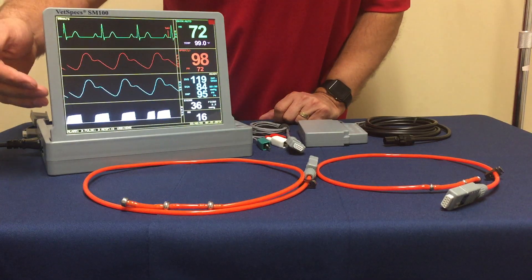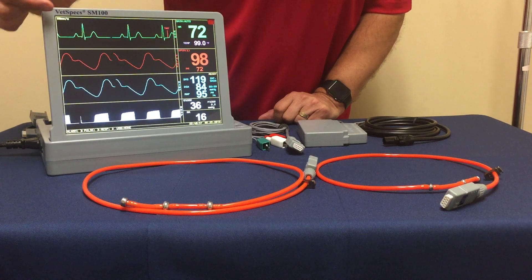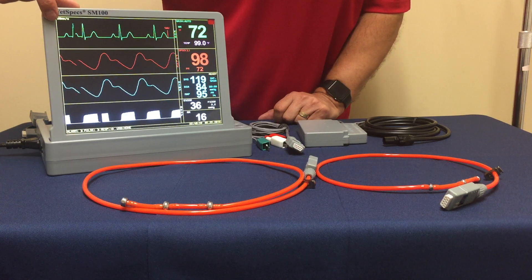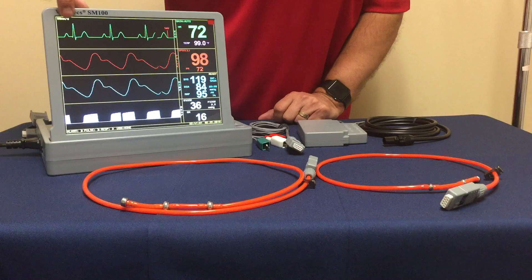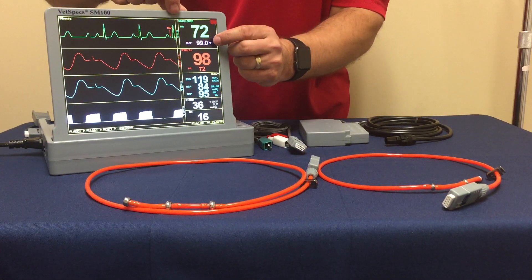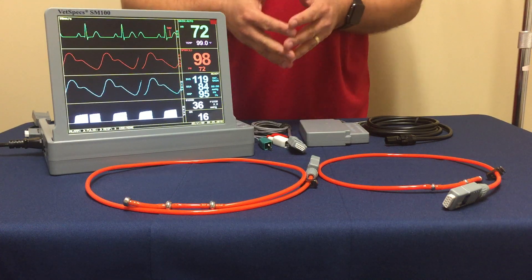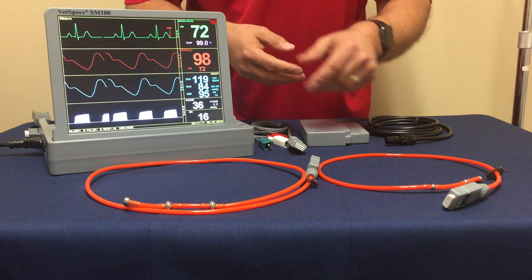If you could take a look and focus your attention on the SM100 monitoring display, we're going to be looking mostly at the top channel or waveform, your ECG, heart rate, and then the core body temperature. All this information is offered by the esophageal probe when inserted into the esophagus.